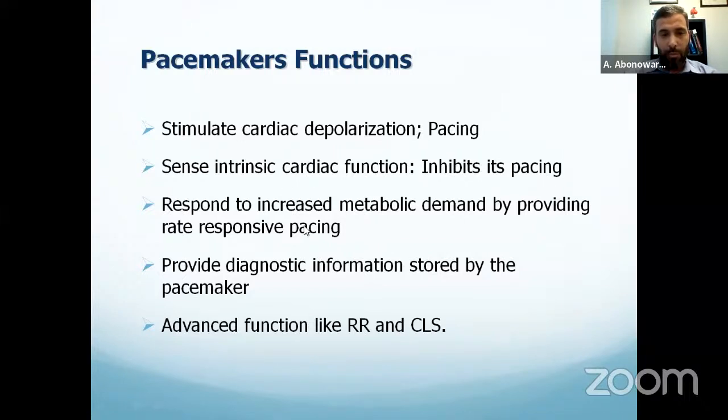The other one is responding to increased metabolic demand, the so-called rate response. So if the heart rate is always fixed at 60 per minute and the patient is doing activity, we have this function called rate response. The heart rate goes up automatically by the pacemaker sensing the metabolic function, pH and muscle movements, and increases the heart rate up to the upper heart rate allowed by the pacemaker setting. Also, it provides diagnostic information. So the pacemaker is actually a 24/7 monitor that's sitting there, but you have to turn that function on.